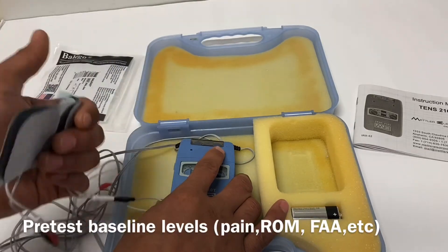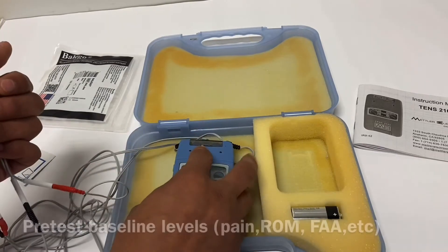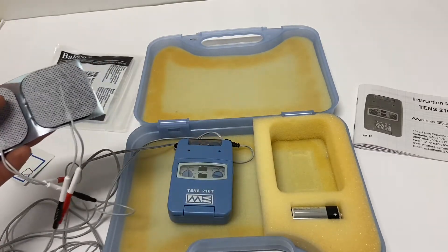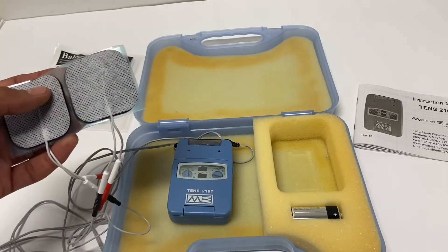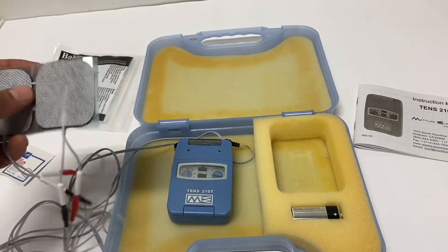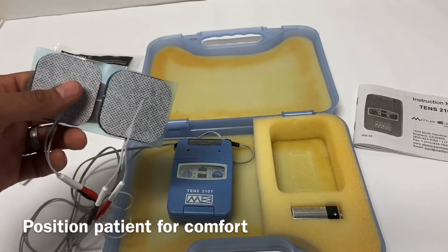If the intent is increased range of motion, then we want to get a baseline range of motion measurement. Maybe it's a functional activity assessment — the FAA. Whatever the goal is, that's what we're going to get our baseline test on, so we can post-treatment determine if it was effective or not. Next, we want to position the patient in the position they're going to be in, thinking of where the electrodes are going to go.